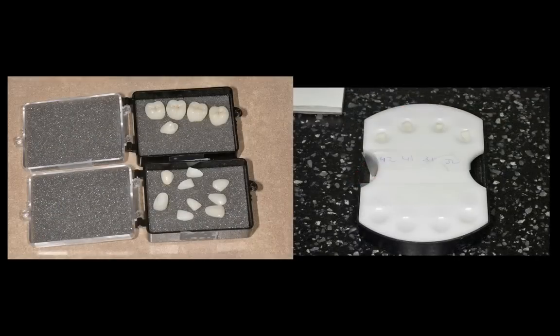This is a particular case that I inserted a couple of weeks ago. It's the second half of a full mouth rehabilitation. I had inserted the upper arch a couple of months ago. I then had the patient test out using the new upper porcelain restorations against the lower plastic restorations because we did some occlusal changes.